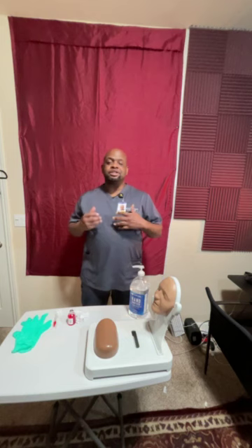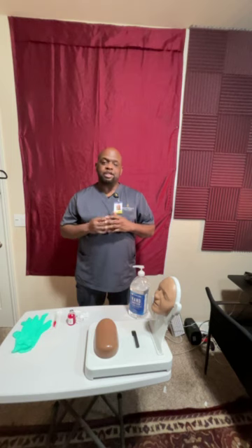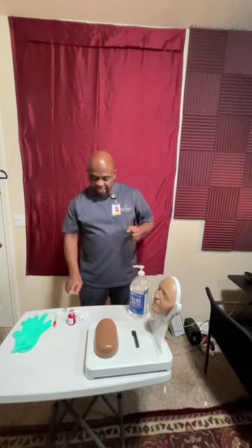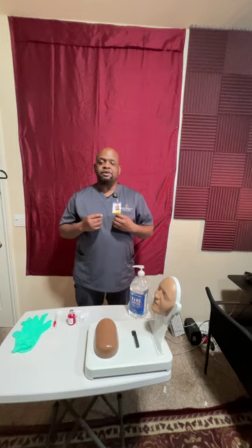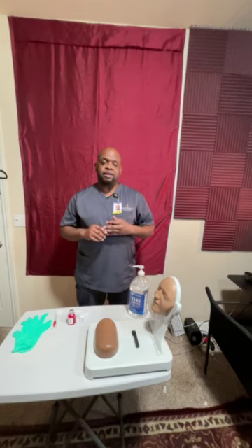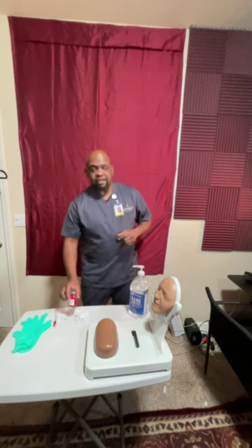So for this video skill, the order says that I am to give a 0.1 milliliter intradermal injection of tuberculin purified protein derivative. What I have on hand in this medication bottle is going to be 5 tuberculin units per 0.1 ml, right? That is what I have in this here.